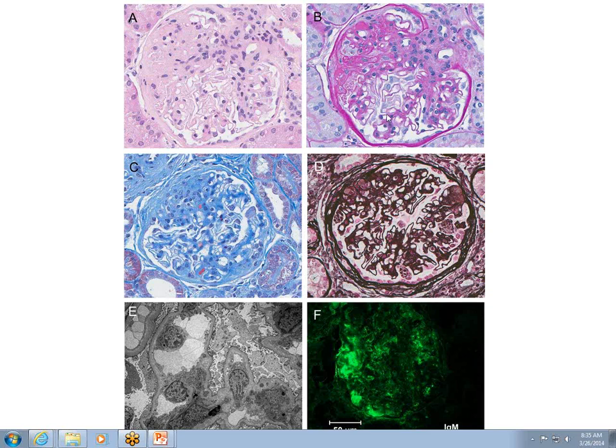If you just see a normal glomerulus, all your capillary loops at the periphery are open and patent, but you see thickened or expanded mesangium, then I only say expanded mesangium. It's once those peripheral capillary loops are gone because of the extracellular matrix and or hyaline, then I say sclerosis. Does that help?